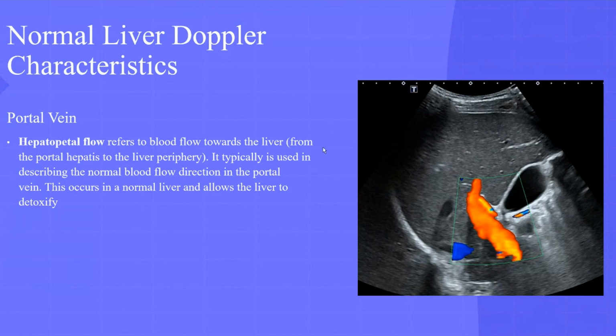So in 2D ultrasound, Doppler will demonstrate this in red color.